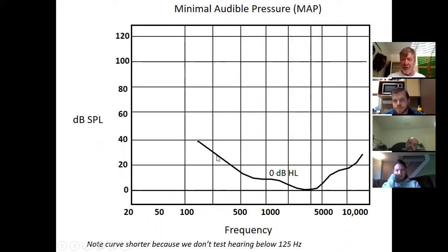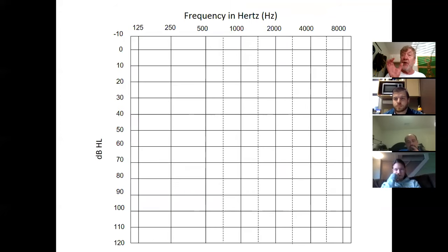because you've got different numbers across the frequencies. I mean, look at all the different decibels from 40 all the way down to zero. You've got very different hearing sensitivity across the frequencies, and we don't feel like dealing with these different frequencies. What we do is we build those differences into your audiometer, into the equipment that tests your hearing. Those differences are built in, and with that having been said, now zero is normal.